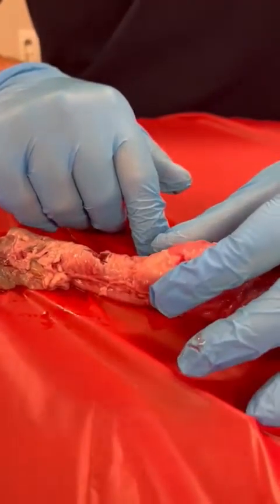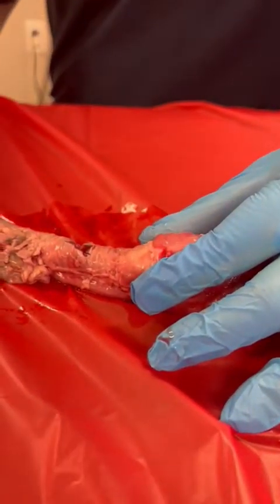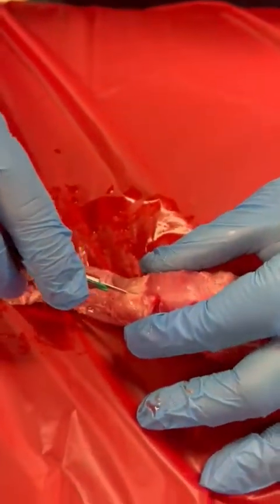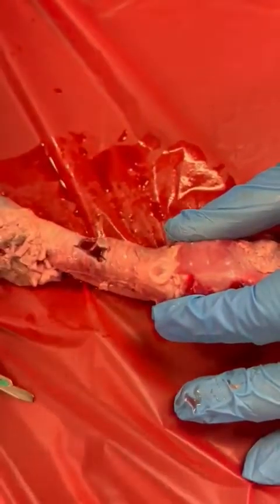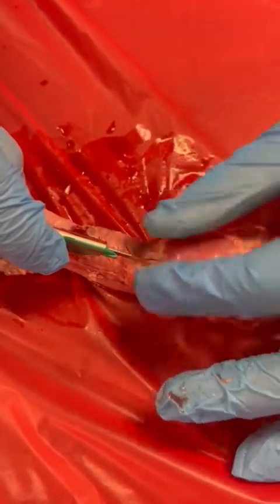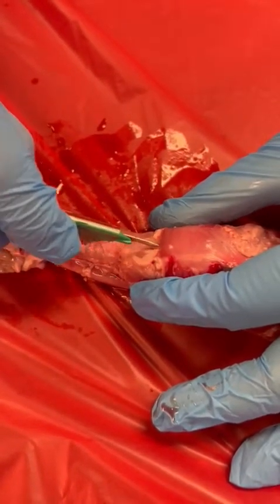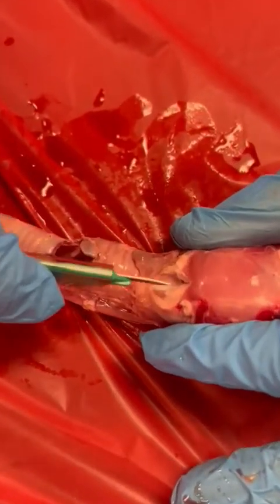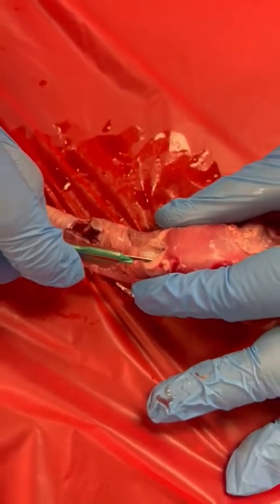Before you cut, always hold the skin taut, as that is going to expose the cricothyroid membrane. The first thing I'm going to do is always provide my vertical incision. As you can see, that skin split allowed me to start to see that membrane. Obviously this is a very sharp scalpel — please be careful. I already disinfected that area. In there we can see that membrane — you can see how white it is. That's the cricothyroid membrane that we are going to try to break through.